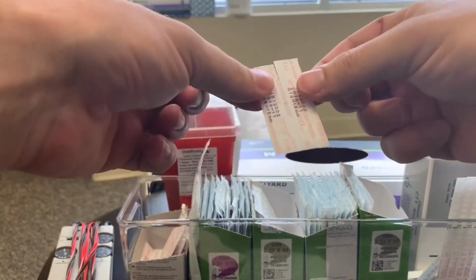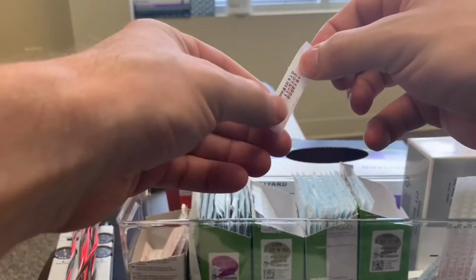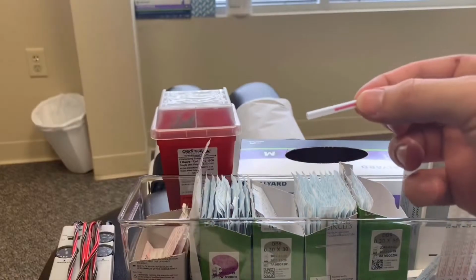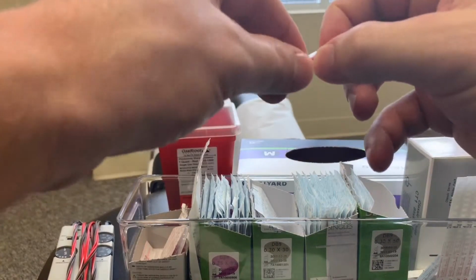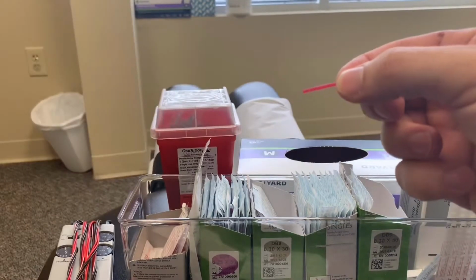Here are some really small ones we use. I'll actually use these more often for acupuncture, but I could use them in dry needling. They are really tiny. So maybe you'd use these when you are needling like a facial muscle. So I'll bust that up. This one actually has a plastic handle. The other one has a spring handle.